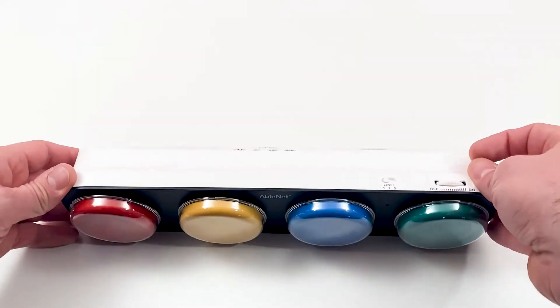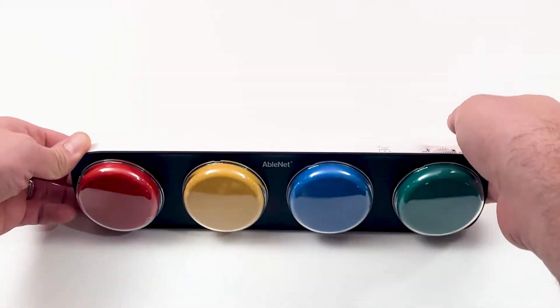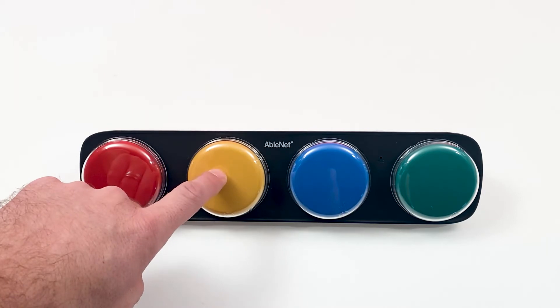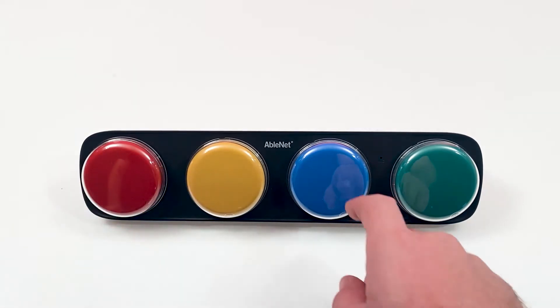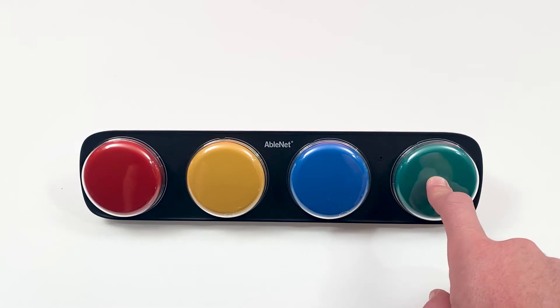Next, I will use the toggle switch to choose a different level. I'm hungry. I'm thirsty. I'm tired. I have to use the bathroom.